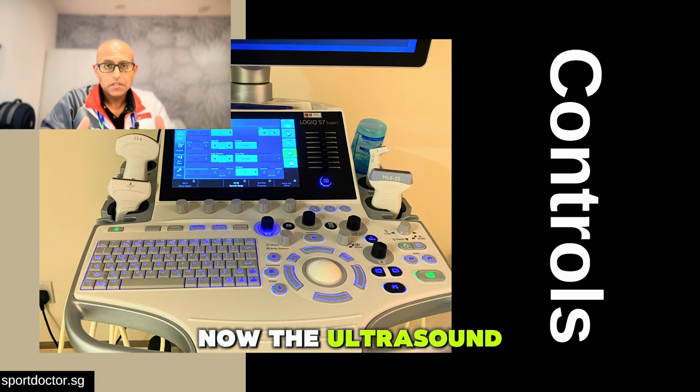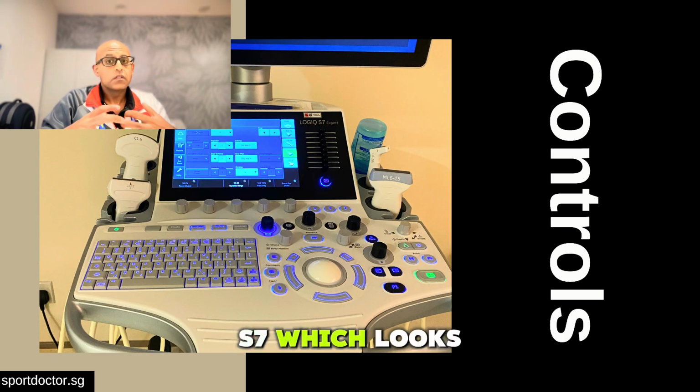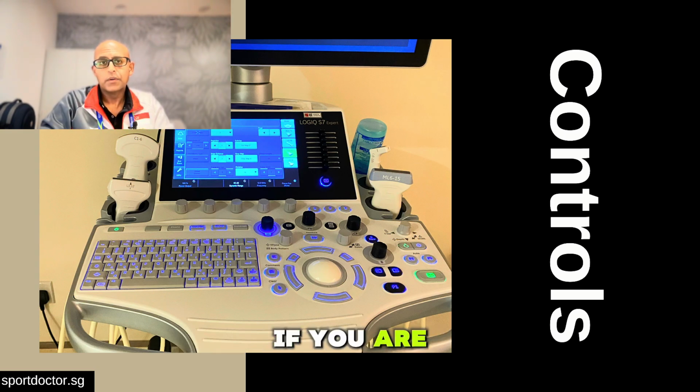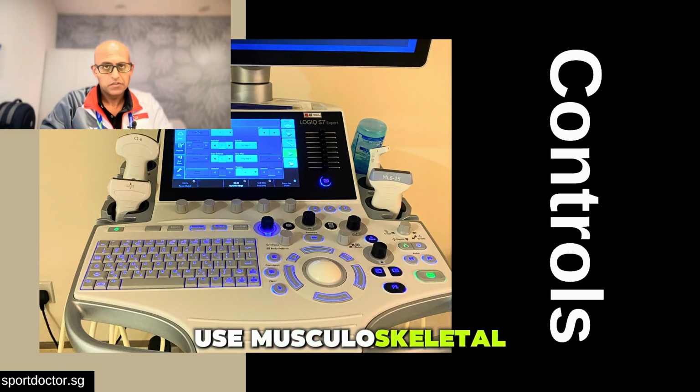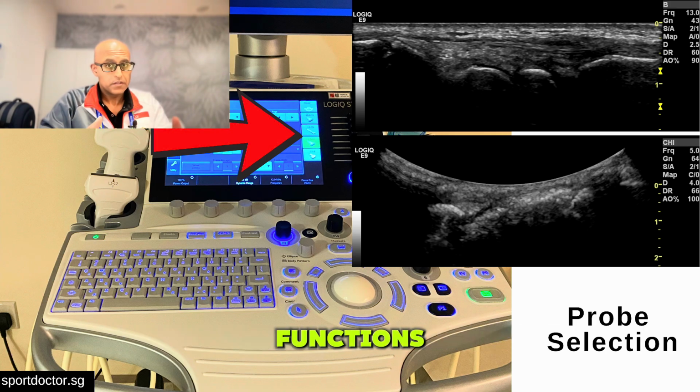Now, the ultrasound machine in this picture is a GE S7, which looks very complicated, but let's break it down to the essential controls that you would need if you are going in to use musculoskeletal ultrasound. Firstly, you need to select the correct probe. Different probes or transducers have different functions.